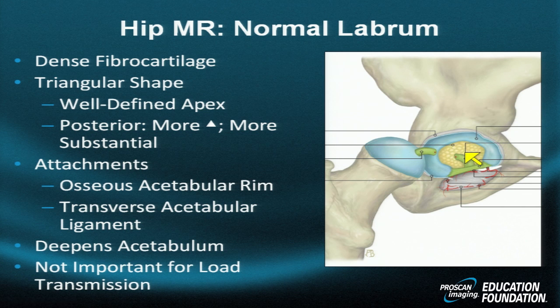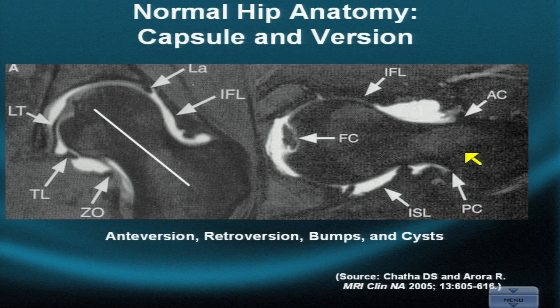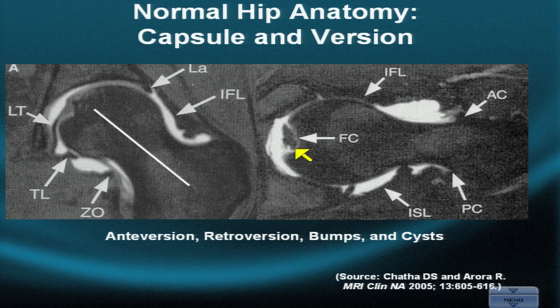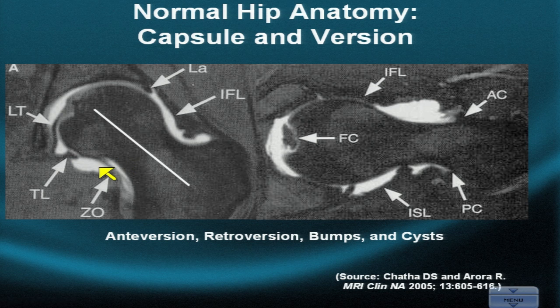Here are two high-resolution MR images of the hip — one para coronal, the other para axial. The para axial is obtained by taking a line bisecting the femoral head, neck, and trochanteric region. A series of para axial images may be used to evaluate anteversion, retroversion, bumps, and cysts.